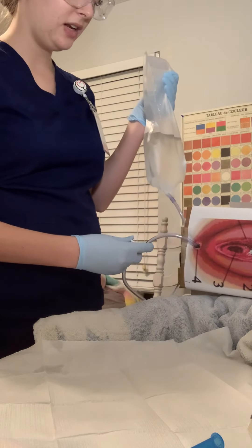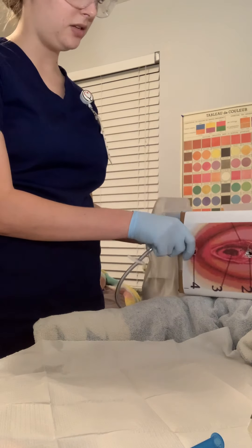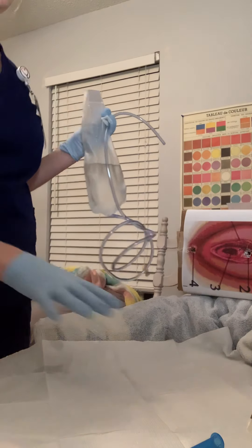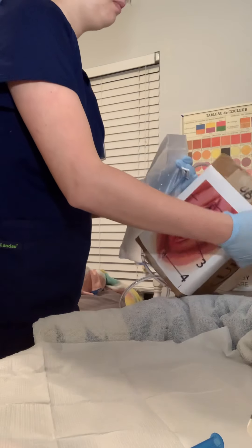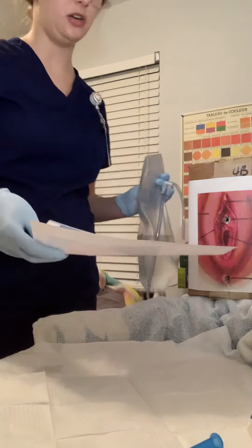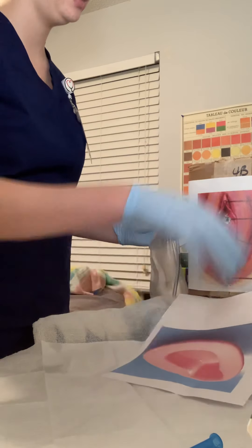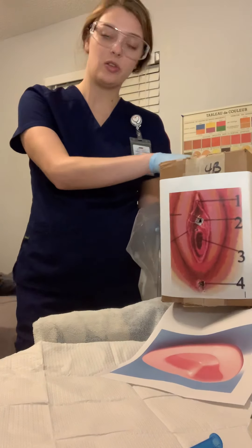When that's finished, I'm going to take out the tubing and place my patient back into normal positioning. I'll place the bed pan underneath them with the larger side towards the back and the narrower side towards the legs, and instruct them to hold it 10 to 15 minutes or as long as possible.